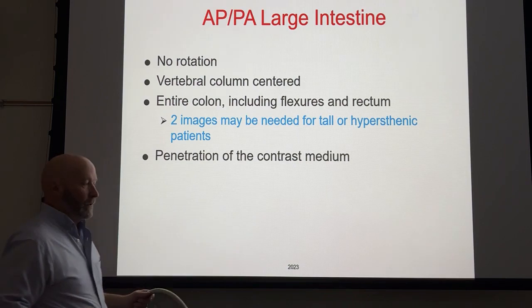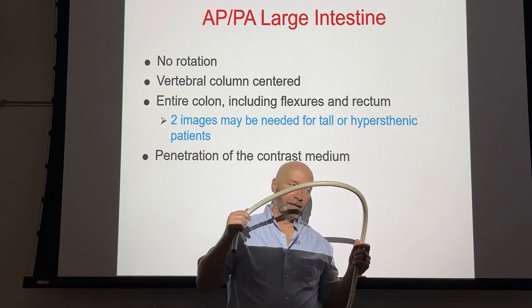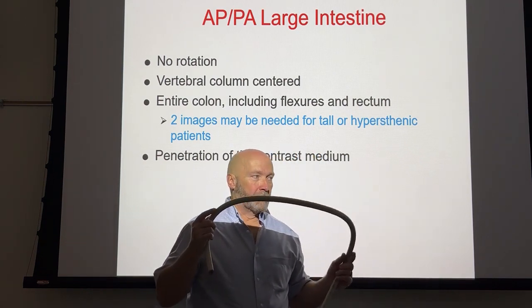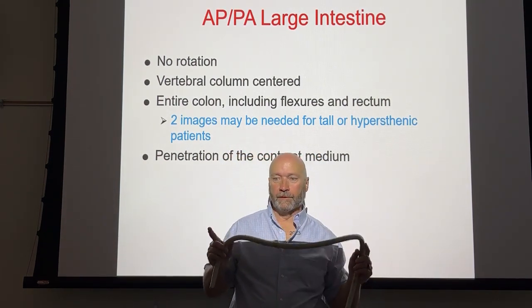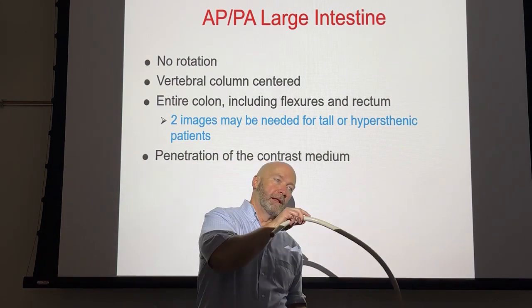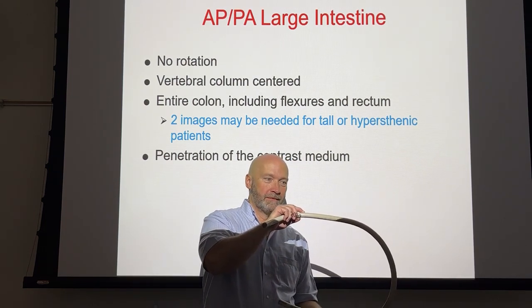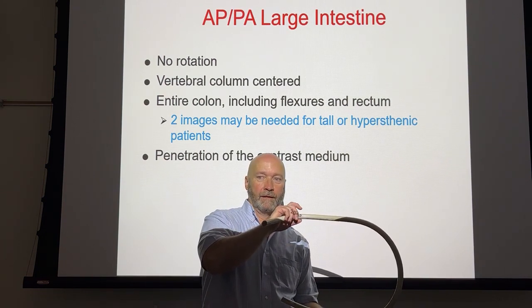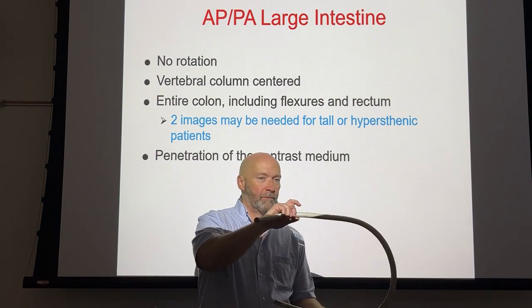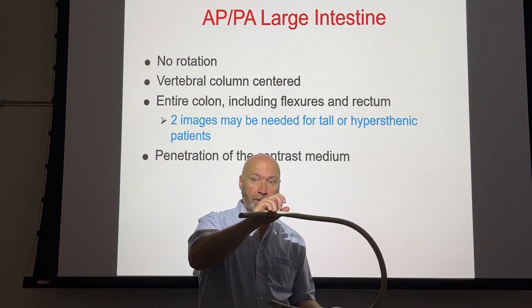All right. So what you're going to do with double contrast exams also is a left lateral decubitus and a right lateral decubitus. All right. So with left lateral decubitus, your test questions are going to be really tricky with these. Okay. If you're looking for the mucosal lining, you put the patient on the left-hand side. Where's the contrast going to be? You've got to think gravity, right? And you've got to think that every portion of the colon is probably going to have some degree of barium still left in it. Okay, it's going to be pooling, but where is it going to be pooling?